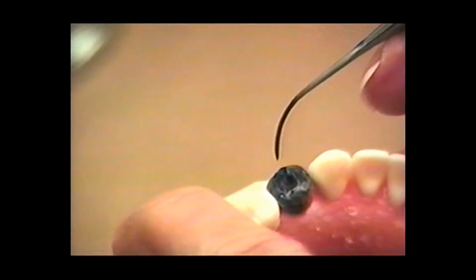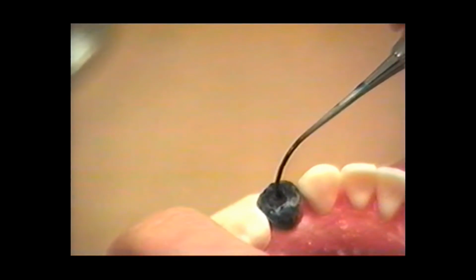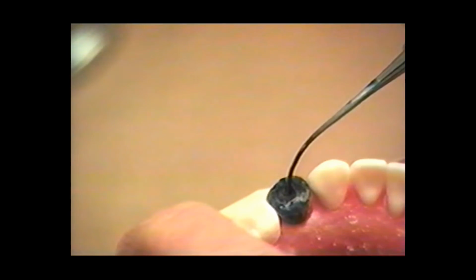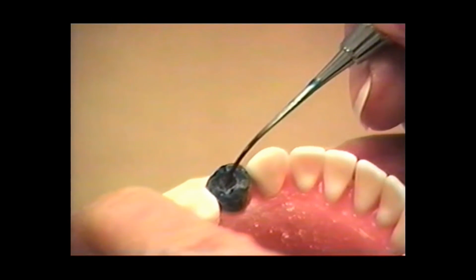I've got a heavy contact on the cusp tip. I've got a heavy contact on the triangular ridge right here. It's right there. I've also got a contact here and here. Now the one right here on the marginal ridge is perfect. I don't want to touch that. That's exactly what we want.